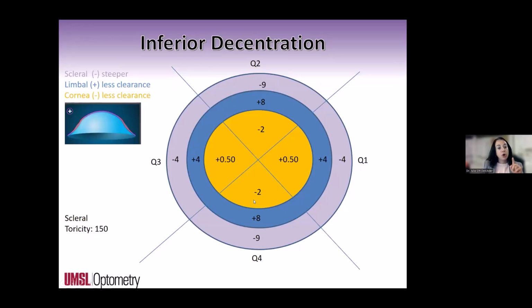We've had to do this multiple times since then. If I have a patient that I'm putting in a lens and they have with-the-rule astigmatism that is more than 3 or 4 diopters, I automatically start with this design now, and it has dramatically enhanced our ability to have lenses that center on the eye right off the bat.